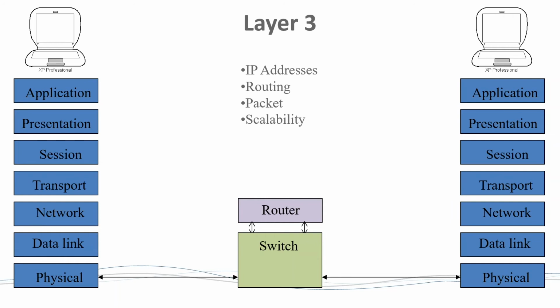You notice I haven't talked about IP addresses hardly at all. The only time they're really used concerning layer 2 is when you're trying to determine ARP, because that's all you have is the IP address. We're talking about routing. When people talk about routing, that's layer 3. Okay?